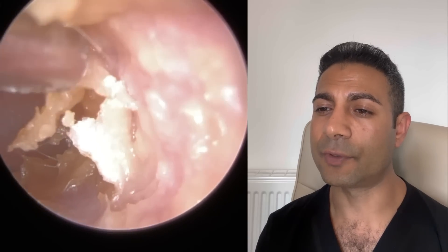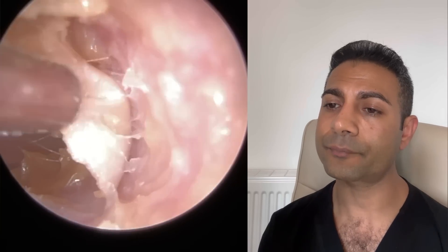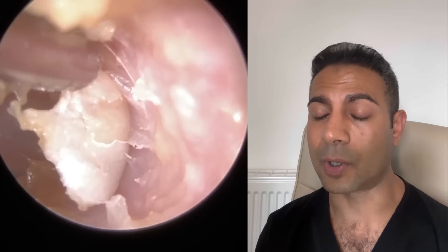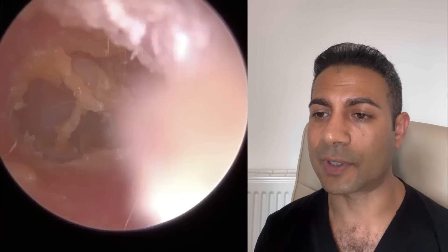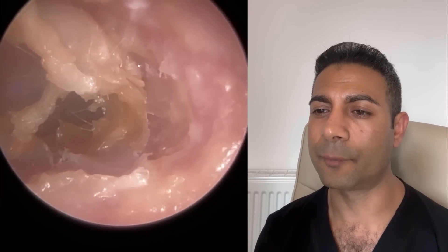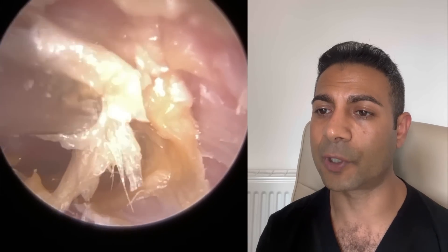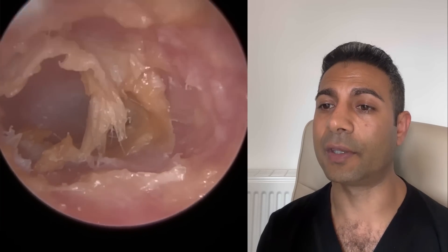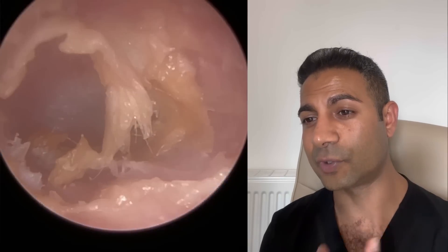They both have their pros and cons. With a zolnir suction probe, there's obviously greater suction power, and the diameter is around 2 or 2.1 millimeters in thickness — you don't really want to exceed that when performing aural microsuction. If you have an increased diameter over that, it can be difficult to insert into the patient's ear. Microsuction is noisy anyway, but with a larger diameter suction probe and more suction power, it's going to be even noisier for the patient.